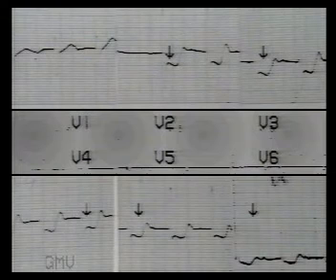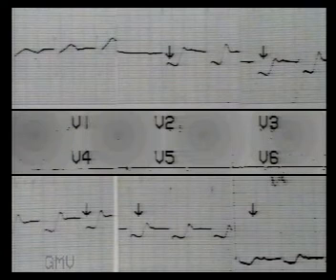In the chest leads, there is reciprocal and marked ST depression from V2 to V6. More the number of leads showing STT changes, more is the severity of the infarct. So this is fresh and extensive inferior wall infarct.